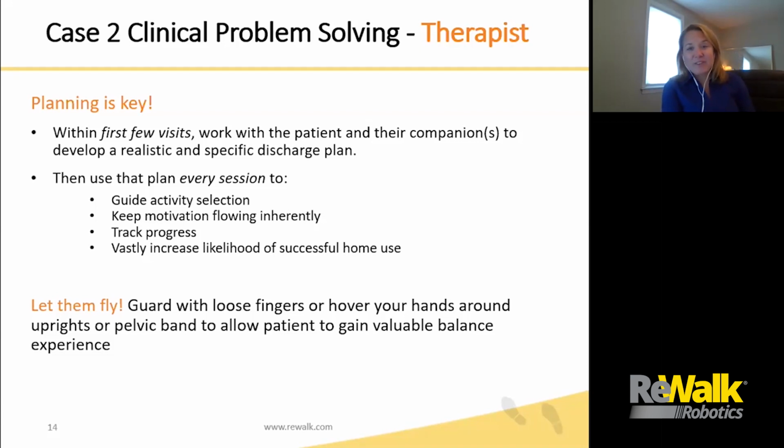And then the other thing that the therapist can do is to let them fly. This is something that anybody who's used to working with gait training and with neurologically impaired patients, it's a struggle. It's something that our instincts tell us to hold people close, right? And so as a patient gets into the more advanced phases, however, and they're really consistent with their crutching, especially with their sort of balance recovery with their crutching.